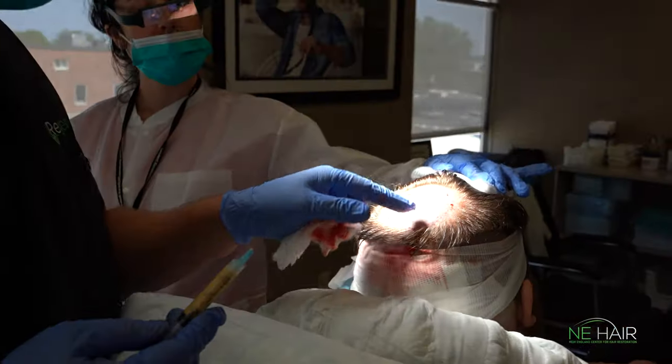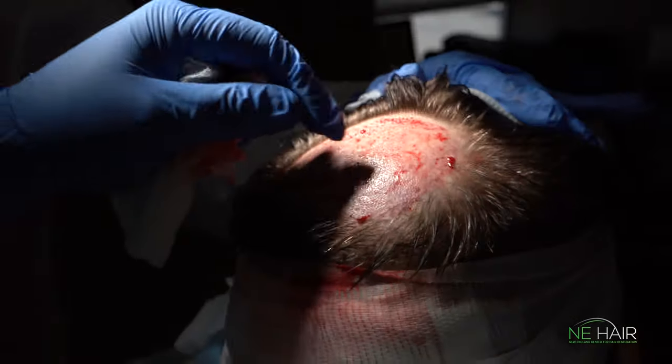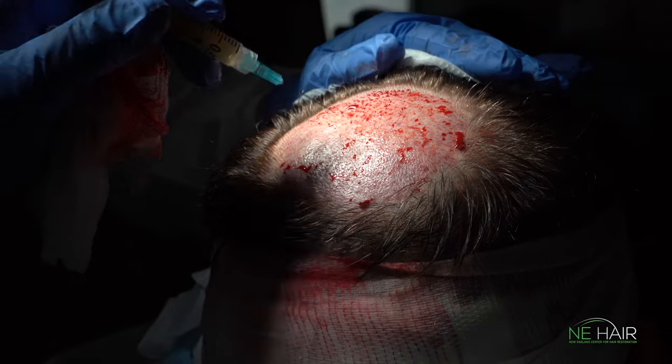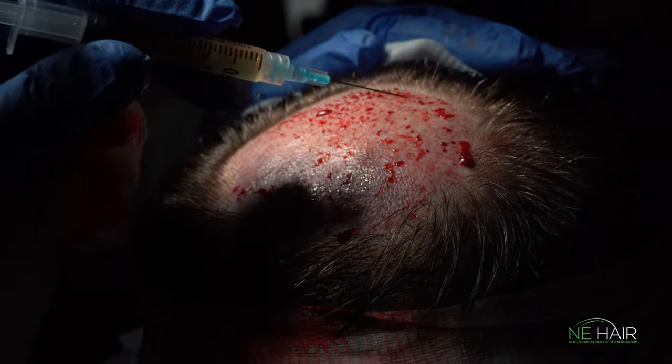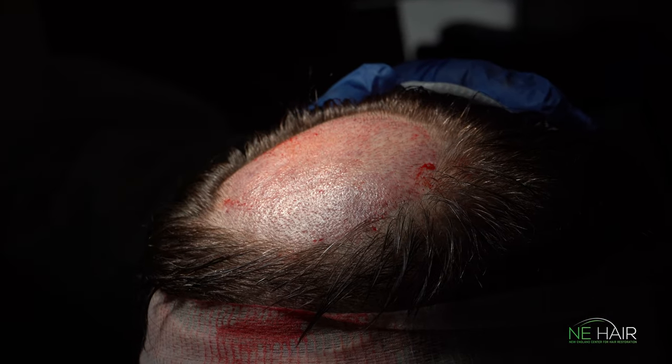We've created all of our graft sites. There's a whirl going around this way with the hair — they come around this way. It starts right here and spins around this way. These hairs are going this way out and going here. You can see this is going to be great density for him once we get him all transplanted in.